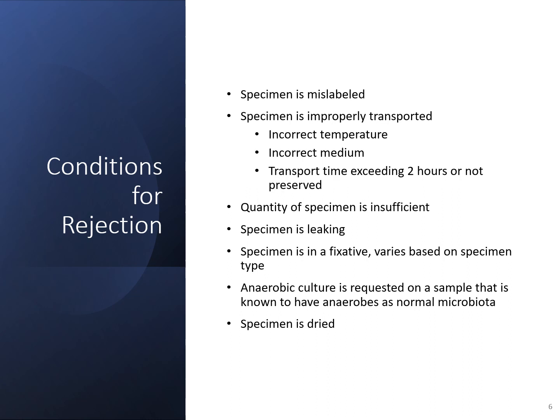If an anaerobic culture is requested, but the source listed on that culture is known to have anaerobic organisms as the normal flora, it would be rejected.